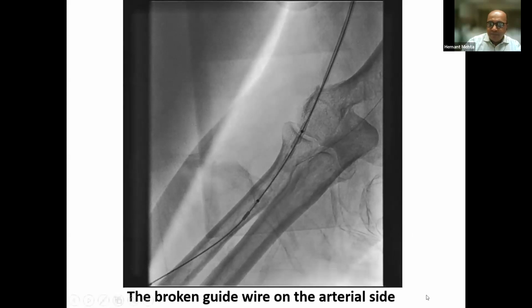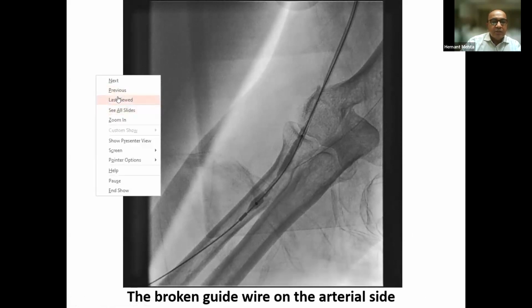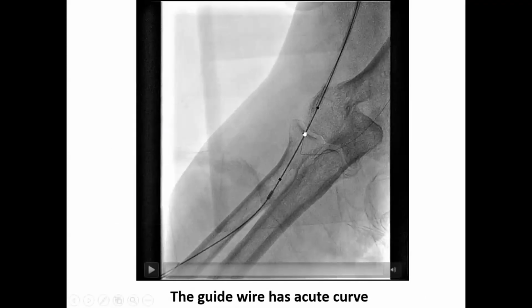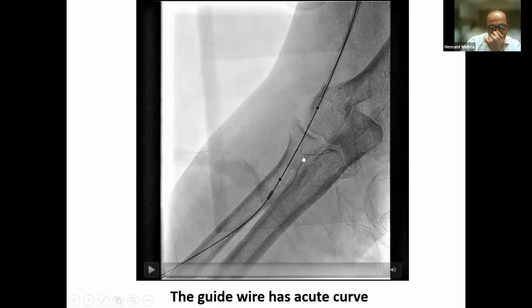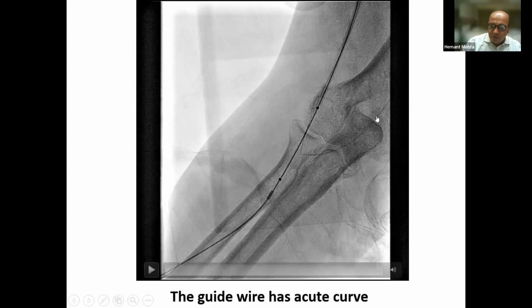Now you see the wire which came from the vein, and we tried to put it into the artery, already had a kink over here. That was probably because of the angulation of the fistula, which was already existing. So we decided to leave that wire, just so as not to lose access, and put another wire all the way onto the vein, and decided to do plasty over there.